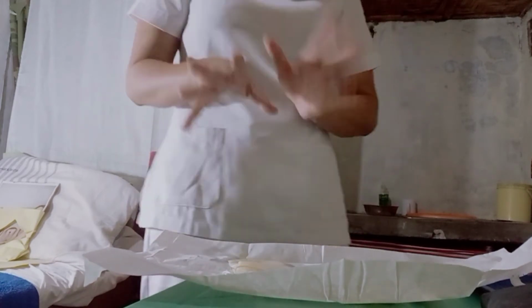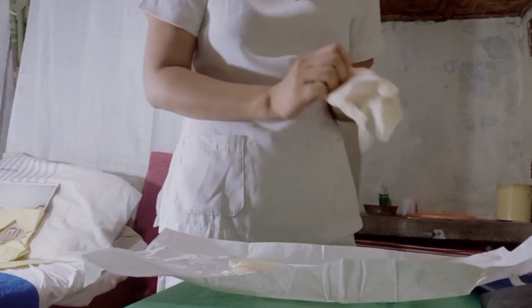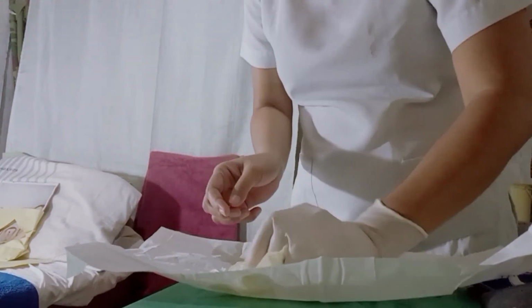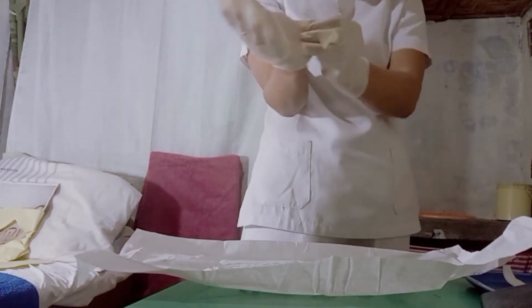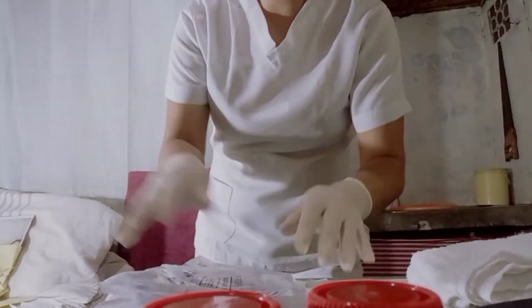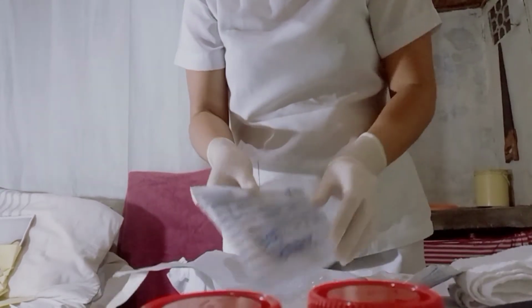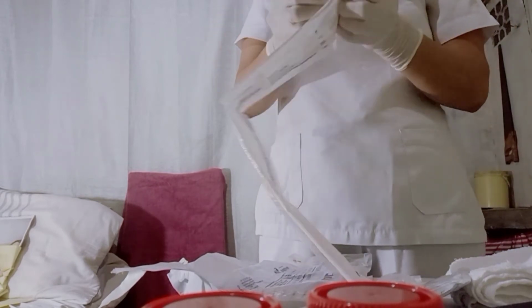Starting with your non-dominant hand or your dominant hand, my dominant hand is my right hand, pick up the gloves and put them on. Lubricate 1 to 2 inches of the catheter tip and place it carefully on the tray so the tip is secured in the tray. So carefully open this.